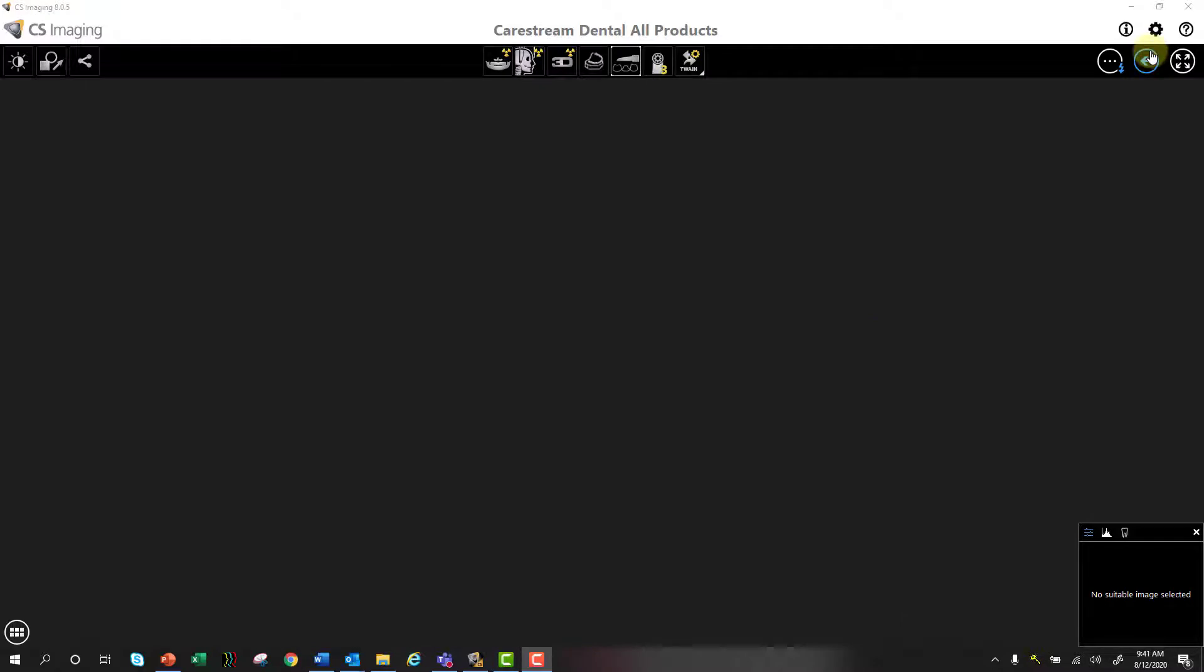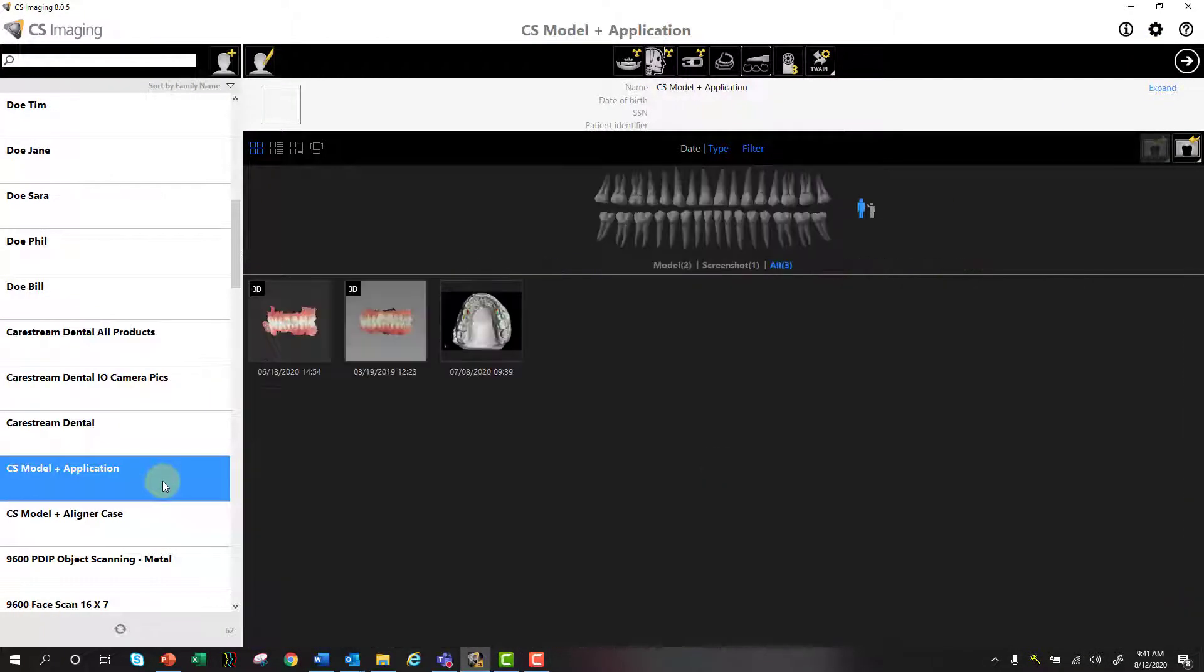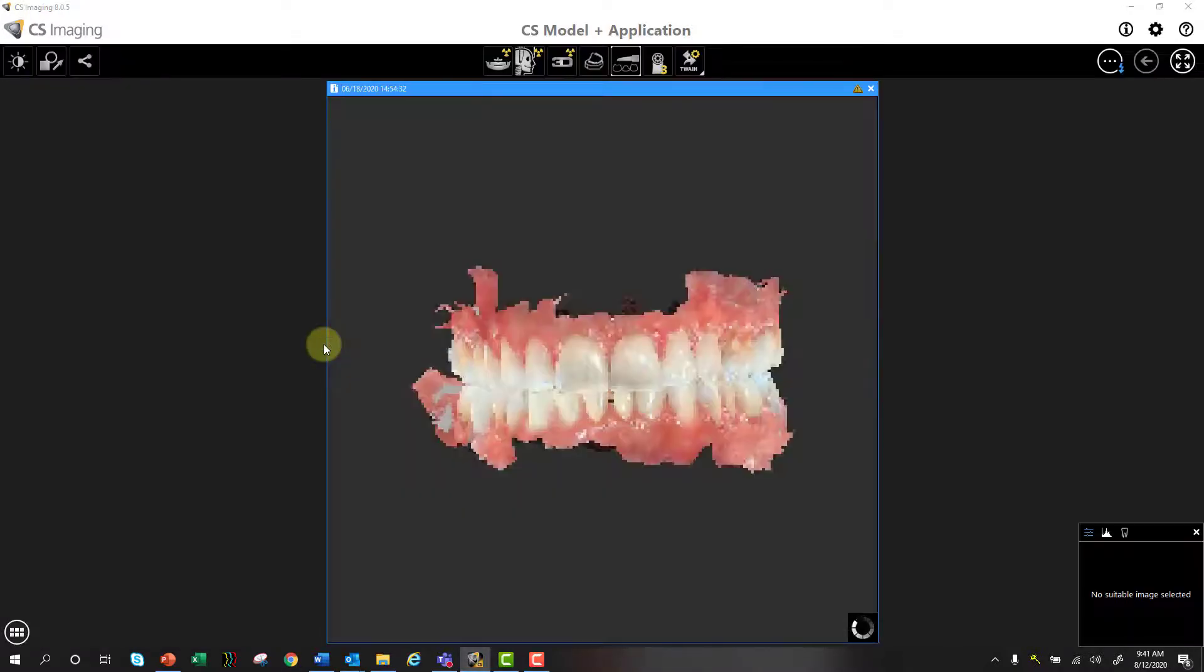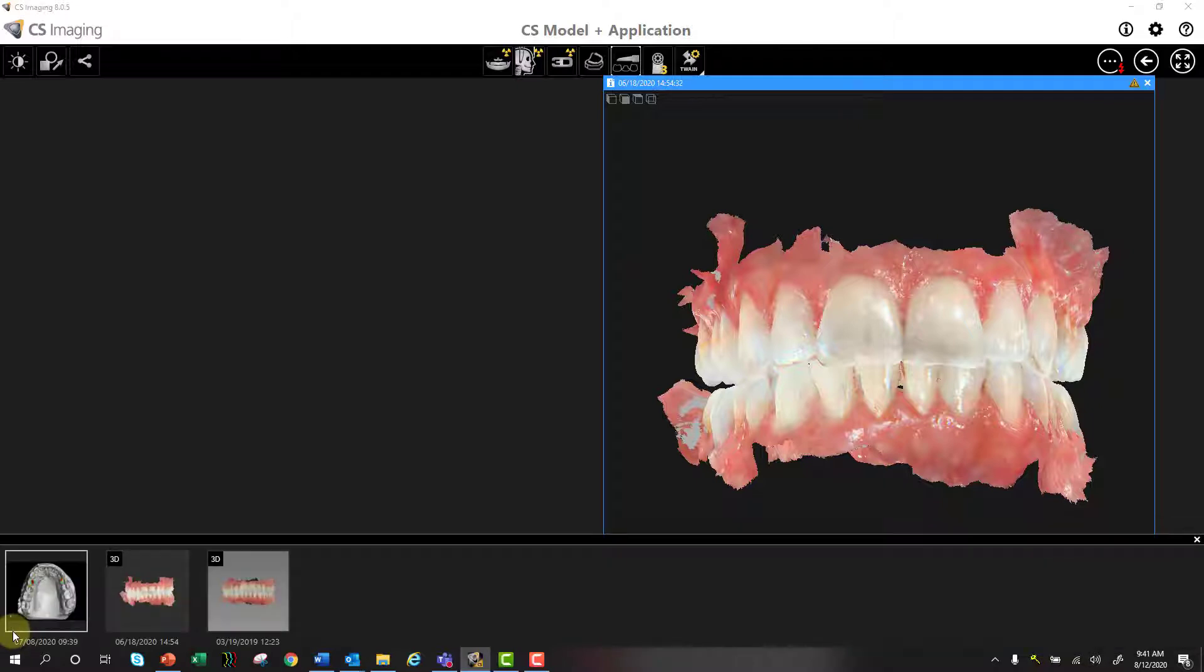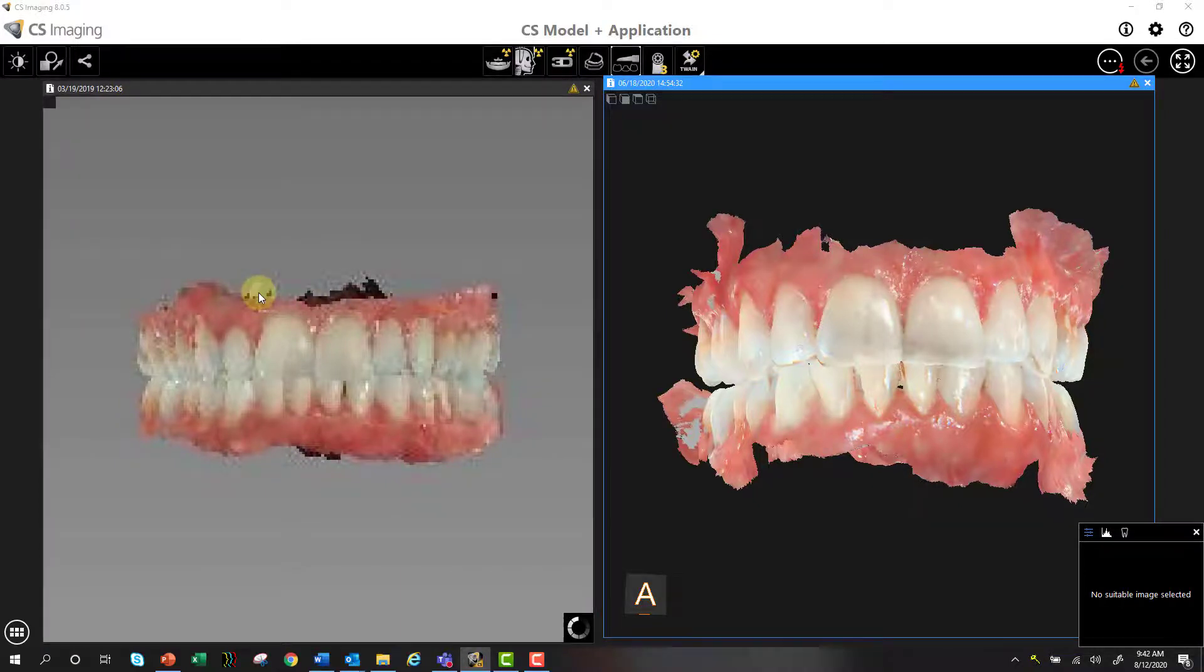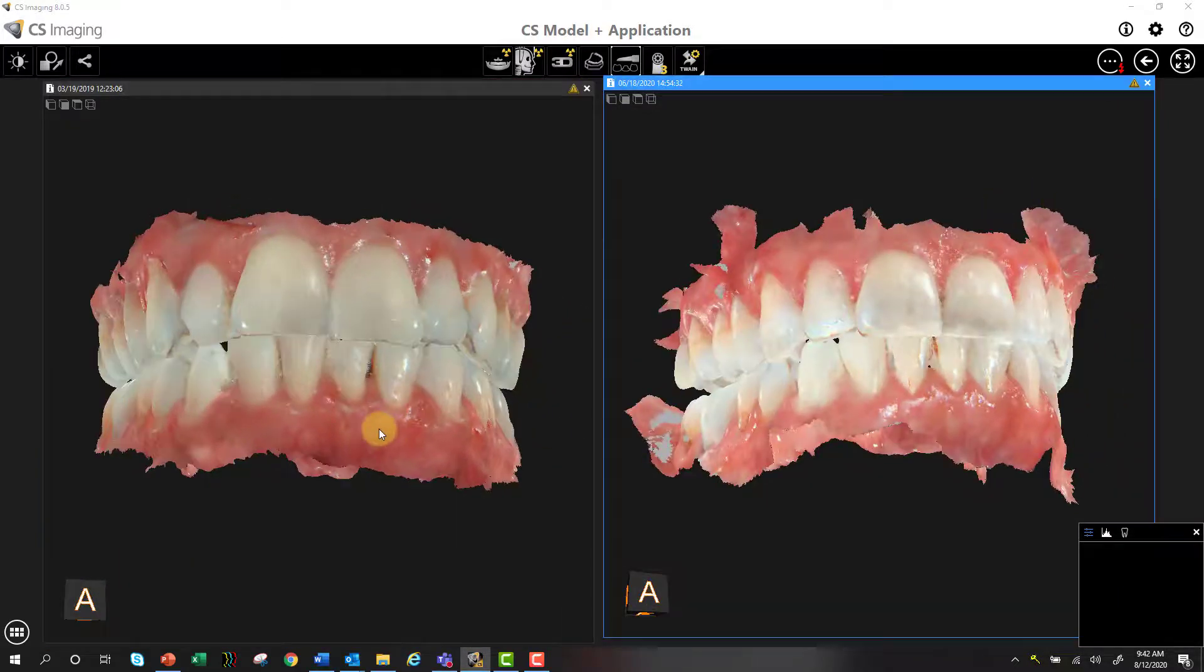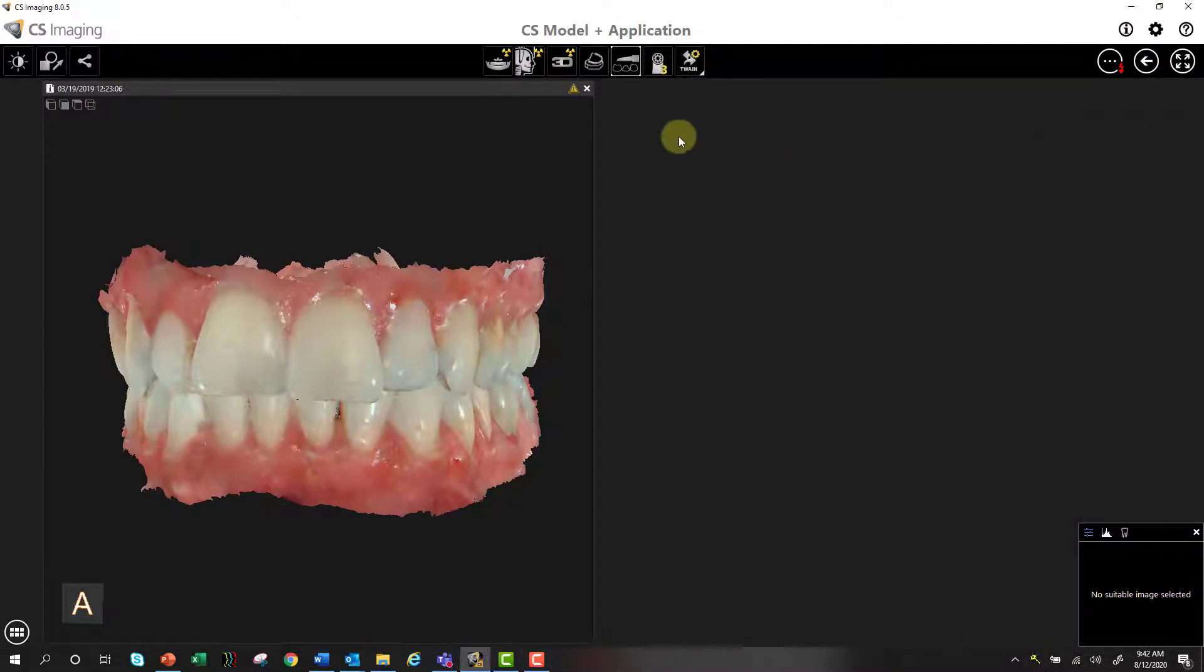One nice new feature that CSI 8 allows you to do is I can actually go into a different patient here that has multiple digital impression files. And what I can do is first launch one with CS Imaging. And when that renders, I have my file here. And what I can do is open up my image gallery down below. That's going to show you the rest of the images I have for that patient. I can left-click and drag that image up and let go. And I can actually view multiple digital impression files simultaneously in the software. So you can show patients before and after or progress during their treatment.